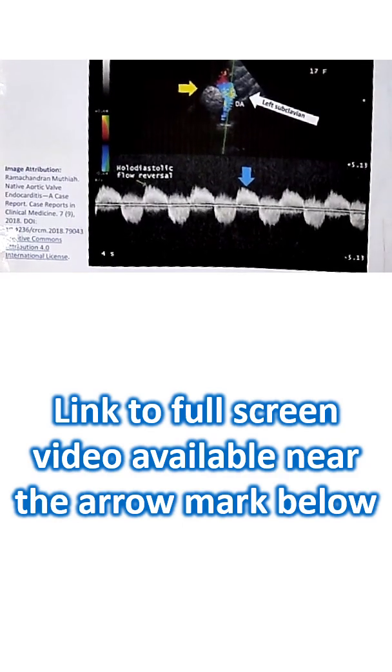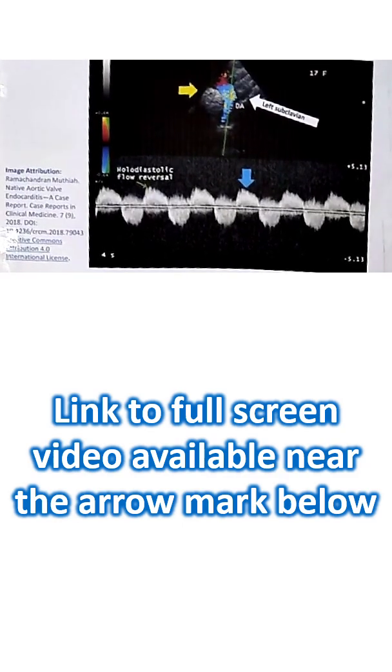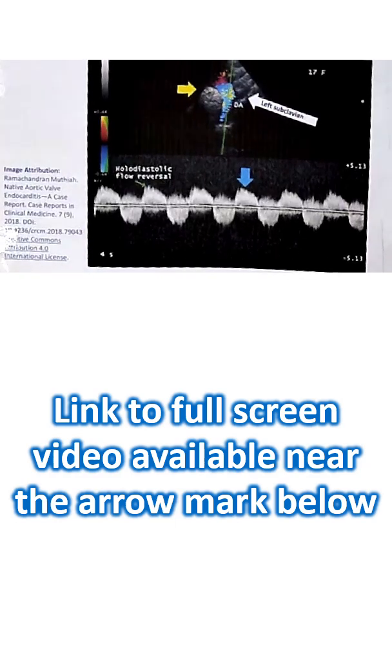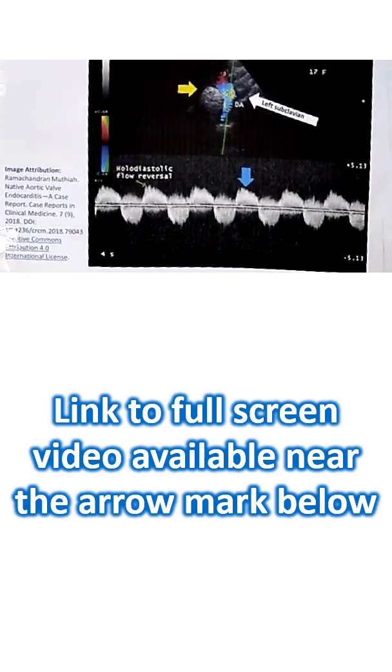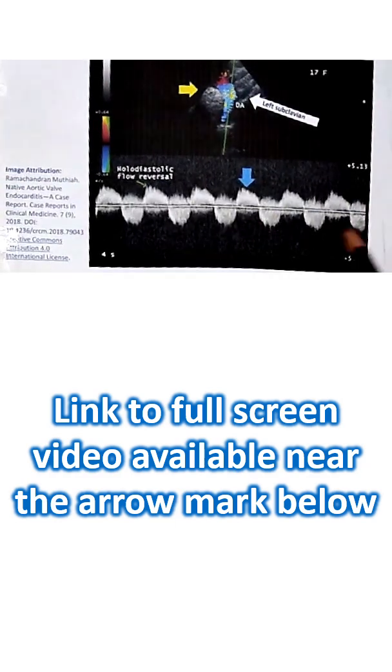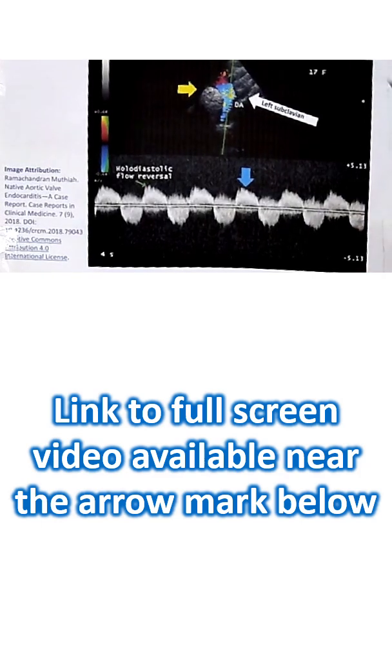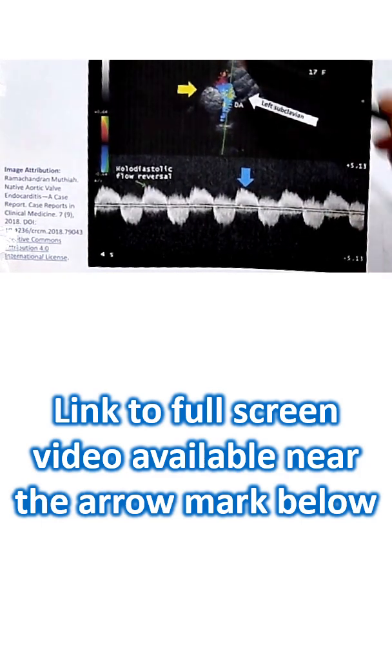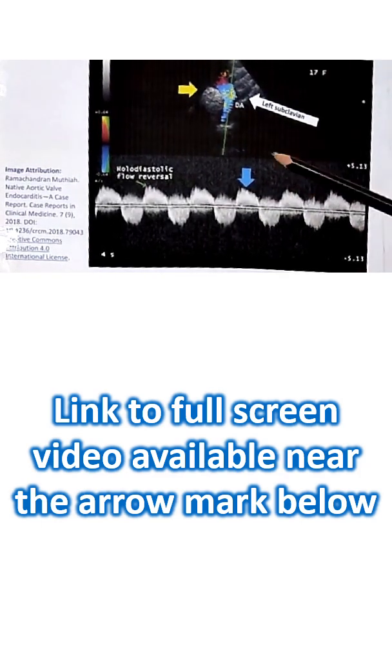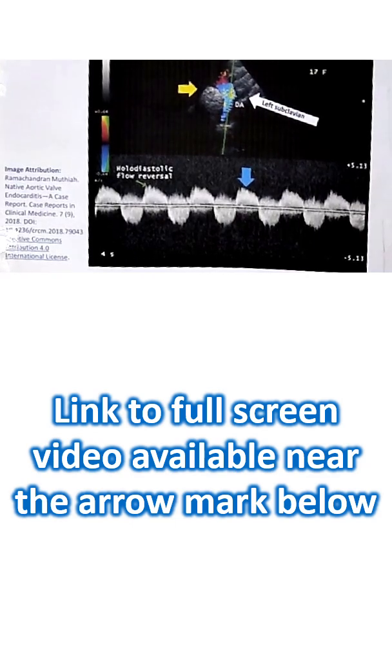Before going to other views in aortic regurgitation, I would like to show this image which is less often used, so it is worth learning. This is the suprasternal view. You are looking for the descending aortic flow reversal in aortic regurgitation.